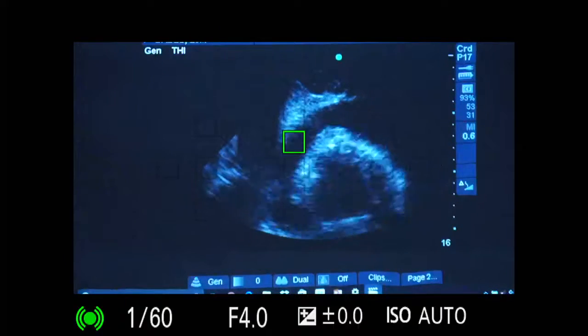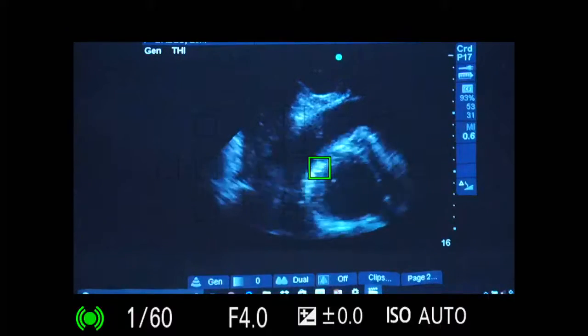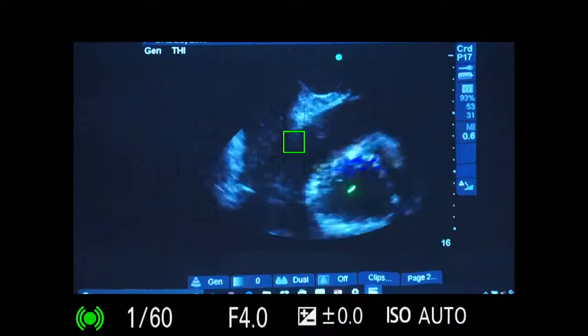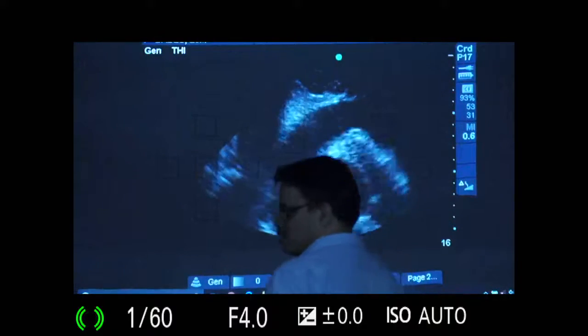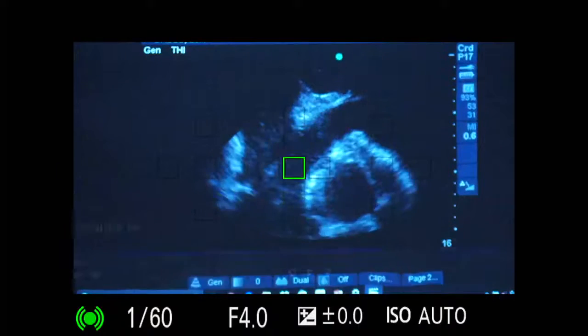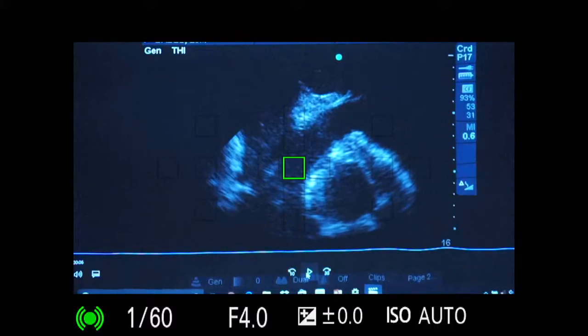And this is the left ventricle. You see the right ventricle diastolic collapse, right. In diastole it is collapsing, right. And you can see the swinging motion of the heart like this. It is floating in the lake of blood. If you take an ECG, what you will see? Sarvan. What is the classical finding?